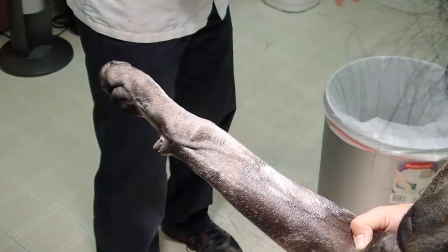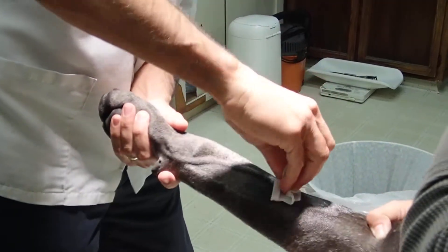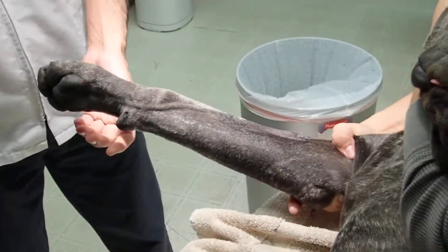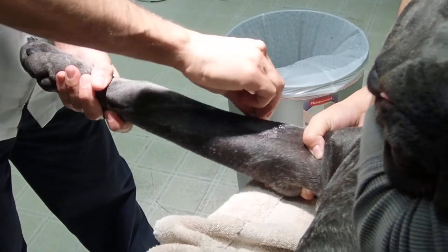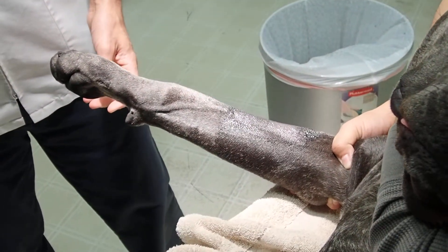She's a very rambunctious dog and she has been premedicated. I'm going to do one more alcohol wipe and one last scrub.